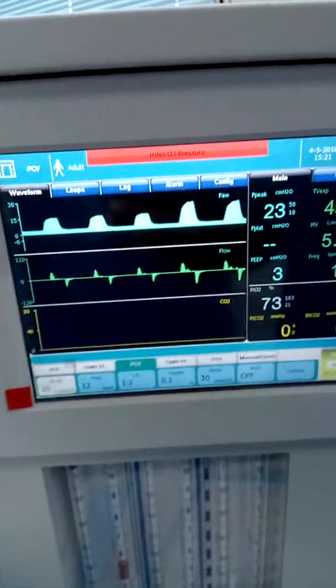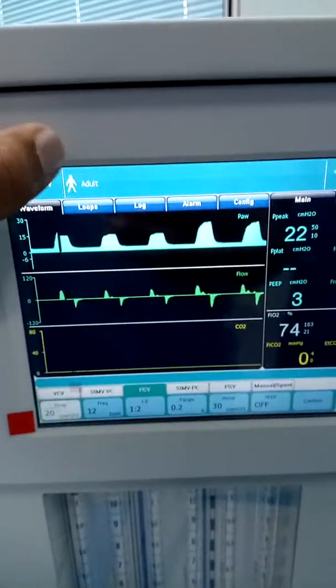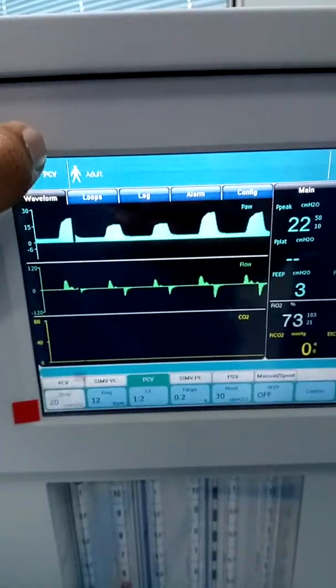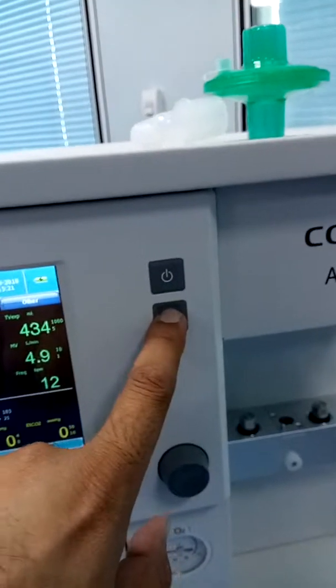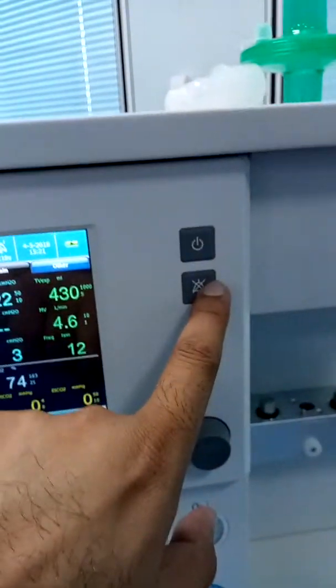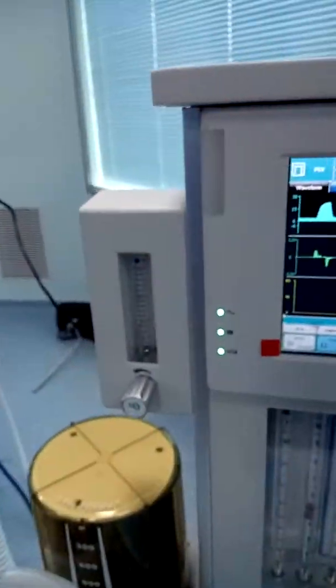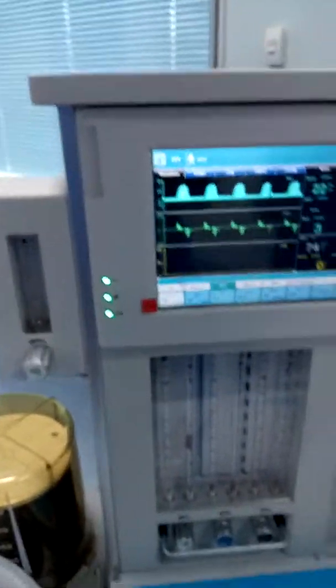Now it is showing an alarm: N2O pressure is low, because we are not using the cylinder. Pipeline pressure is also low, as shown here. You can mute the alarm from here. This is a major alarm and it will continue.